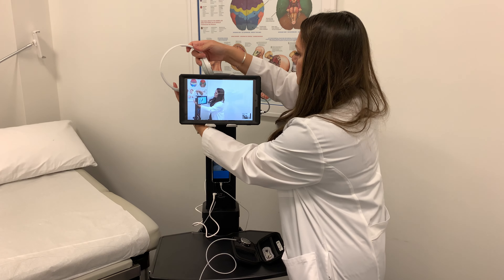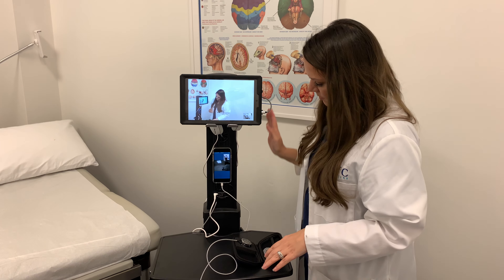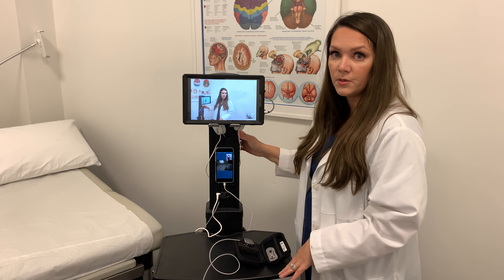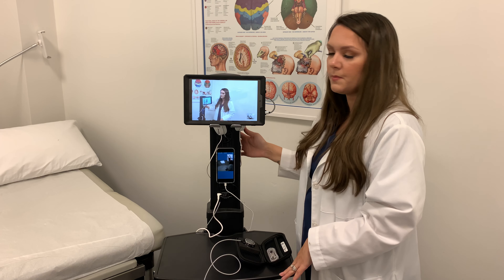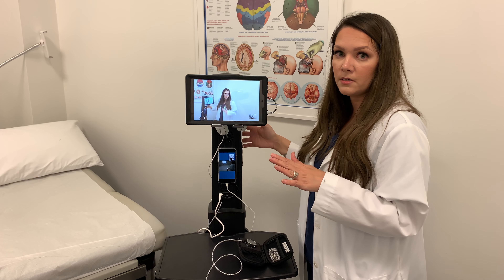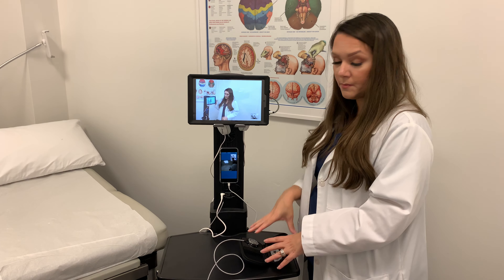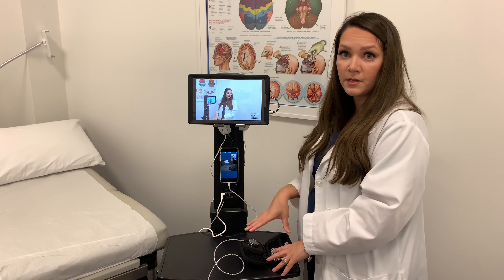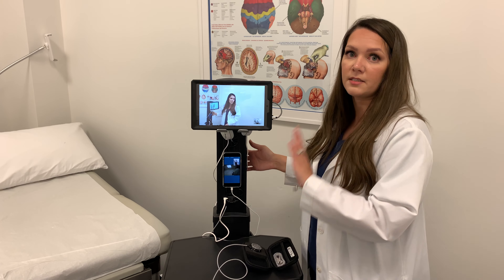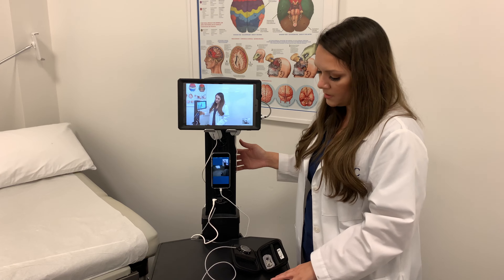Just scroll until you find it — here we go, Stethoscope — and it's going to pop up as well. It is all connected to the same workstation, so it's not like you're going around trying to fumble through and find things. It's all here, and this tiny device connects through the cord.